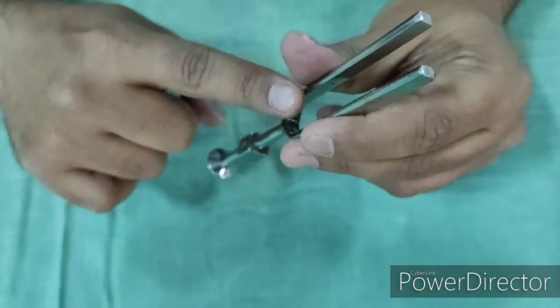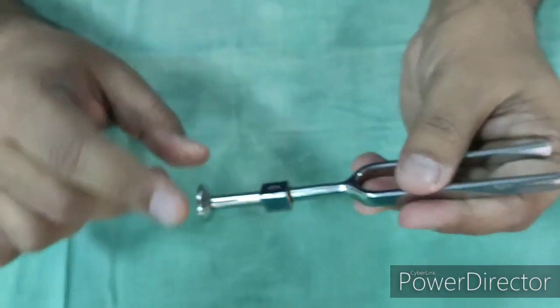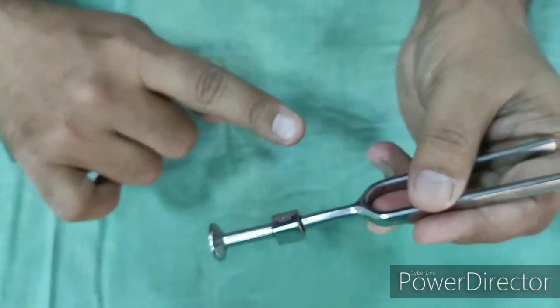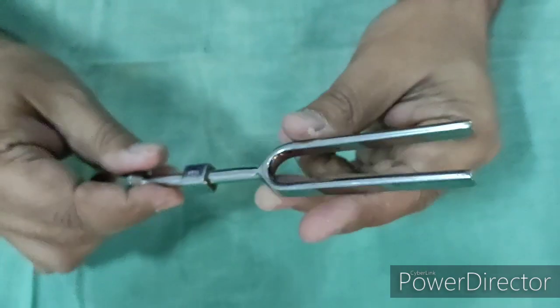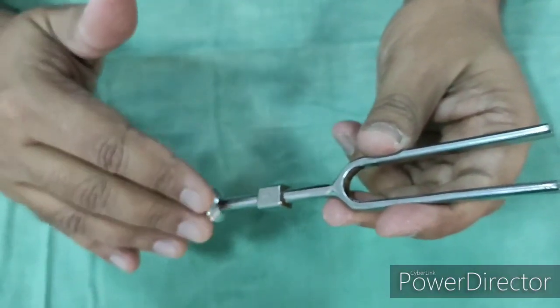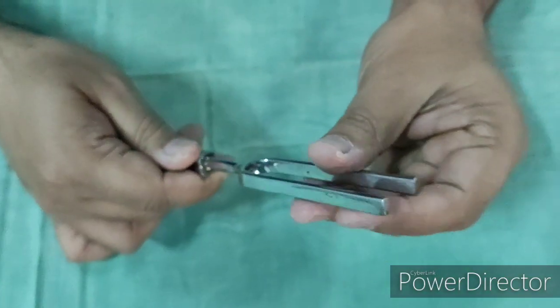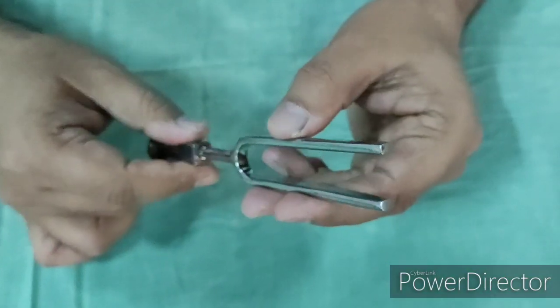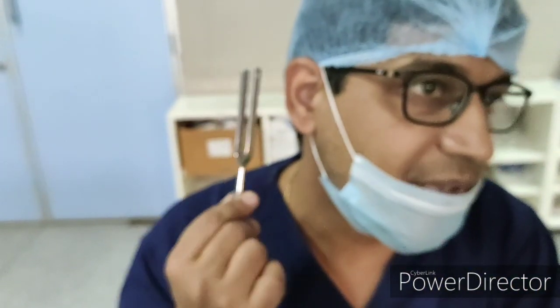The use of the tuning fork is to assess hearing in patients, to know the type of hearing — whether it is conductive or sensorineural — and also to know the degree of hearing. The degree of hearing can be assessed using a battery of tuning forks. After striking the tuning fork, it is kept in the acoustic axis of the canal, at around 1.5 to 2 cm from the external auditory meatus.